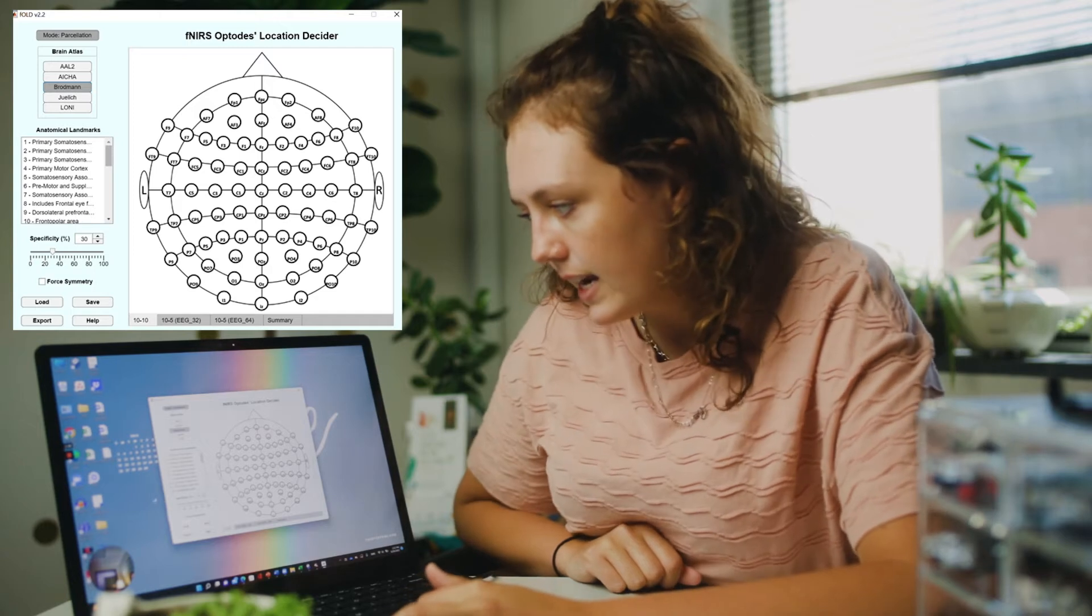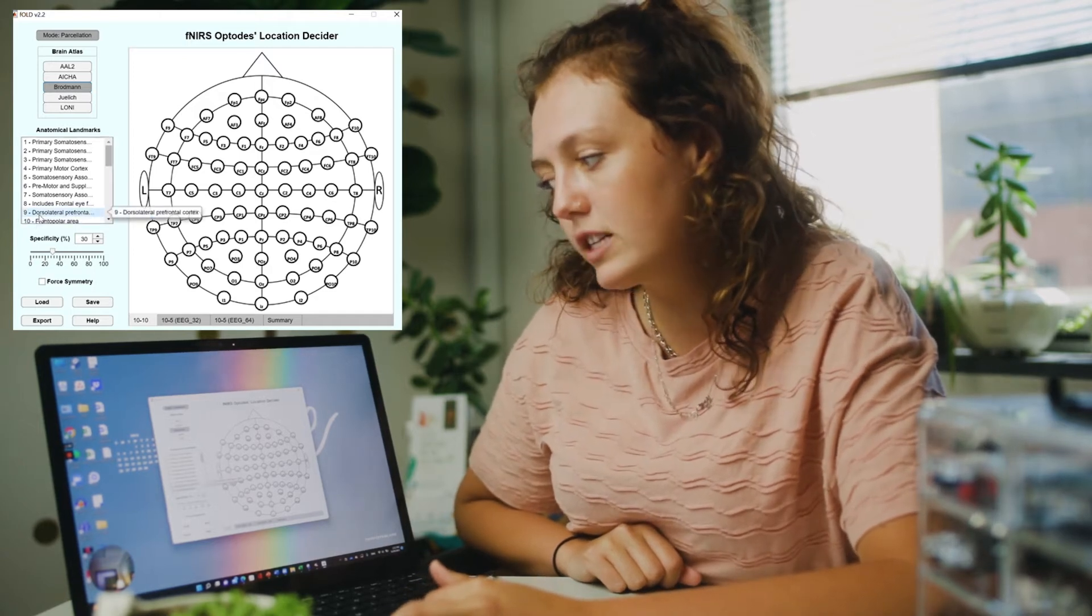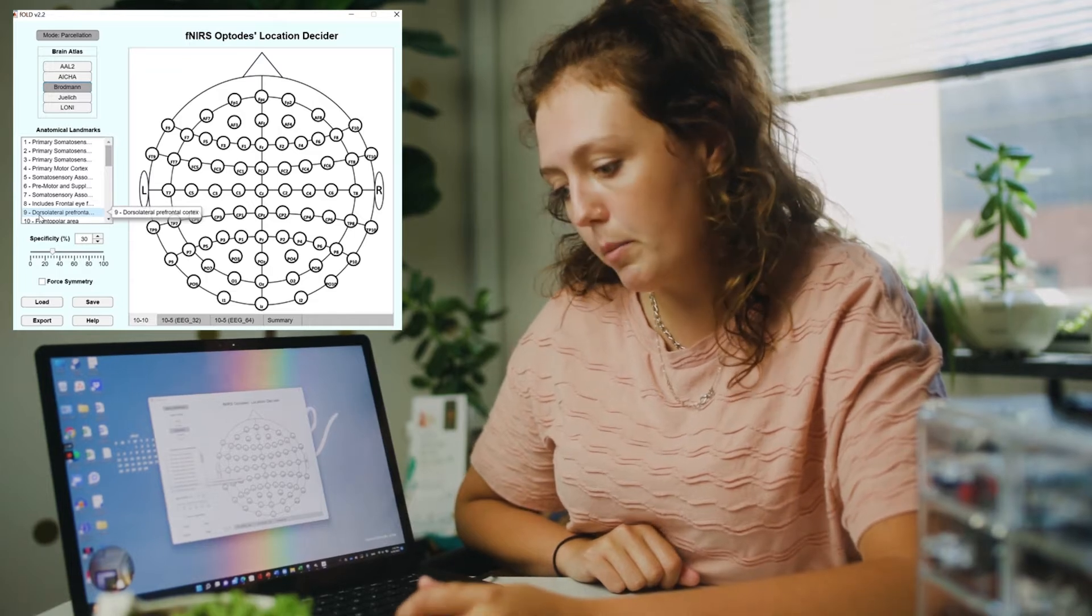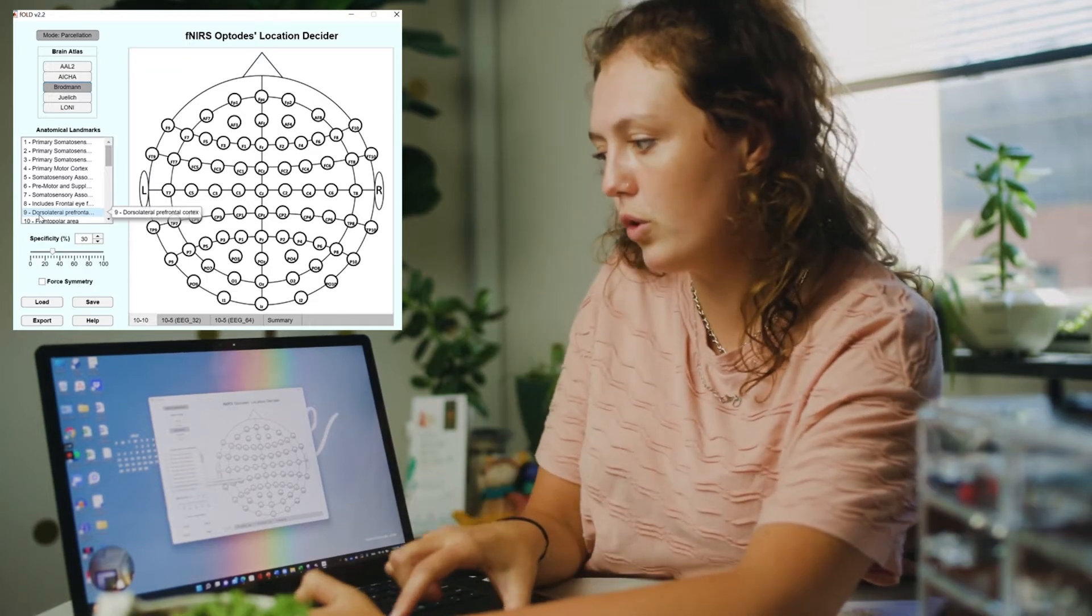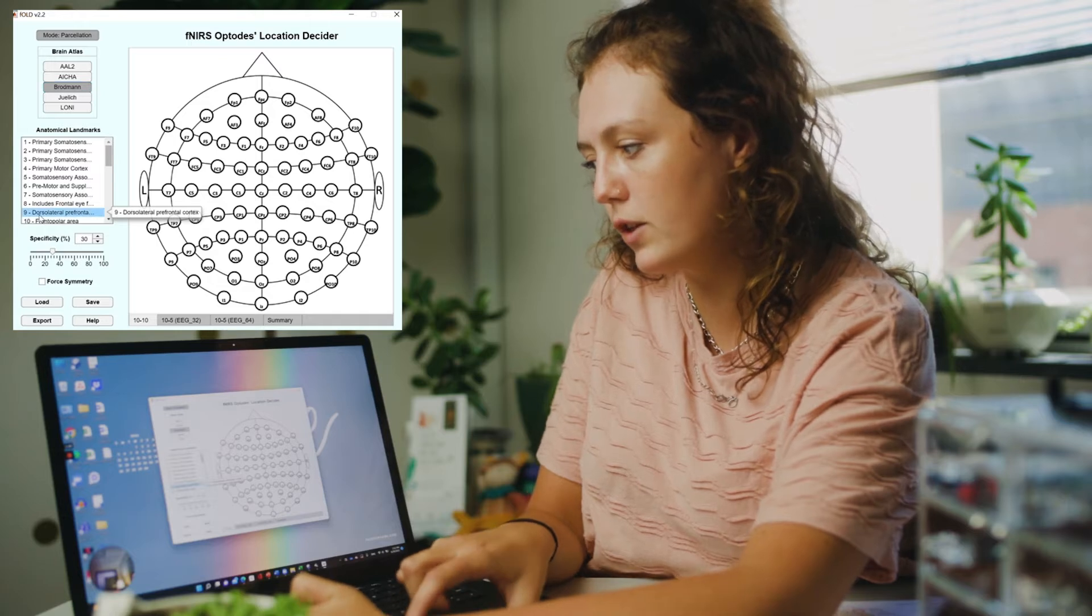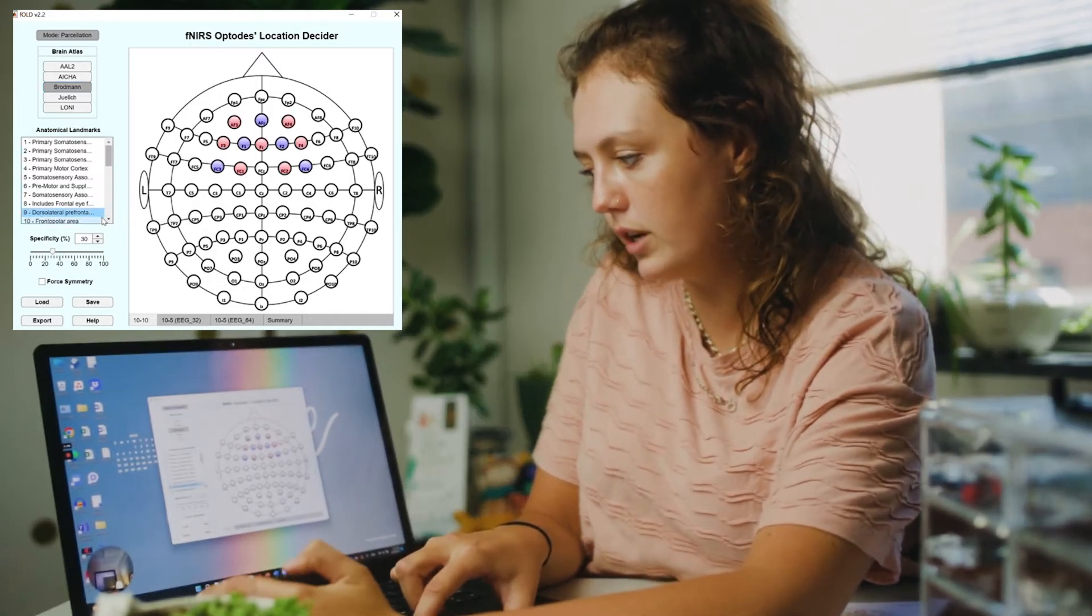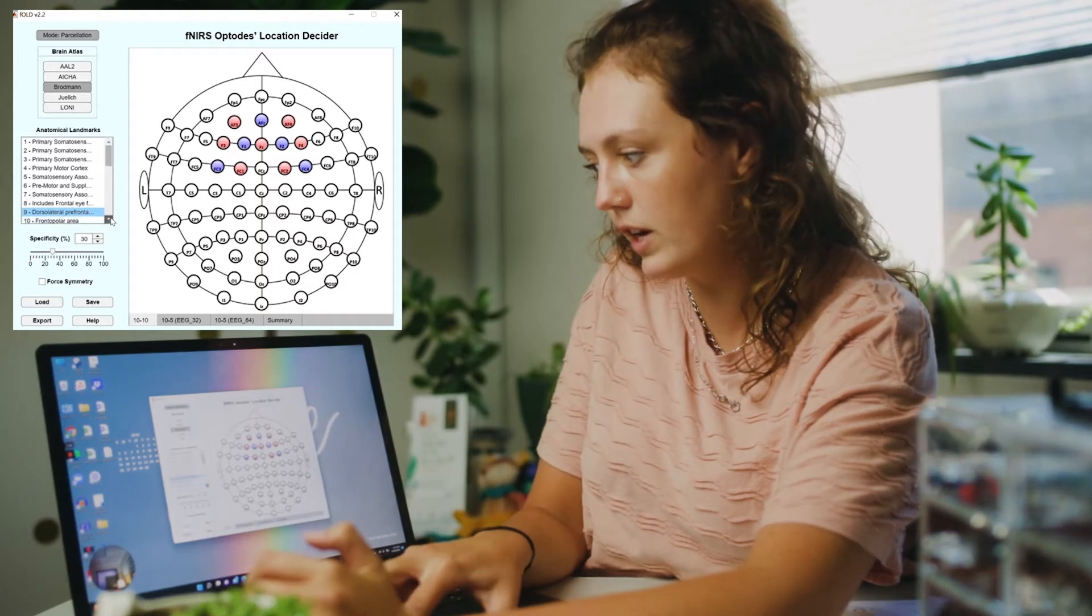So I'm interested in the dorsolateral prefrontal cortex. I'm going to choose the anatomical landmark number nine. I'm going to hold down the control key on my computer and click it, so then I can choose another location without it deselecting the location I've already selected.